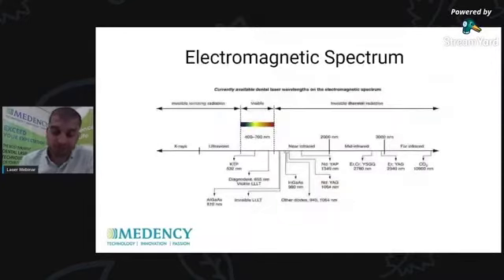After we get our laser, we studied this light generated from our system, and we discovered that the laser has a wavelength in an area called infrared or near infrared. Anything in the world or in our lives, such as X-rays, any light or any rays we use in ordinary life, is called the electromagnetic spectrum. It has a certain wavelength and certain specifications.